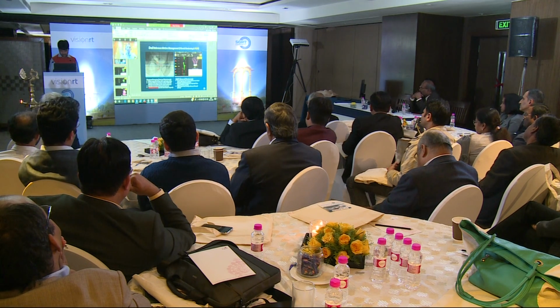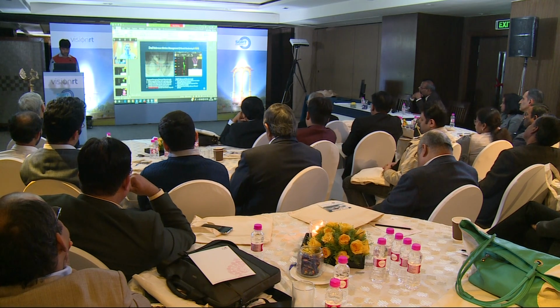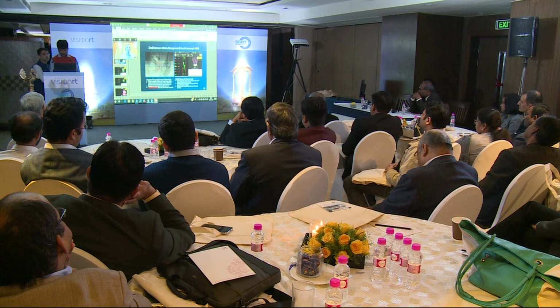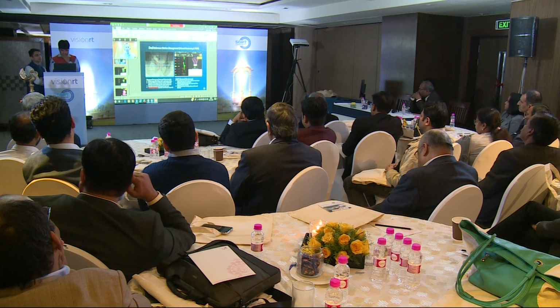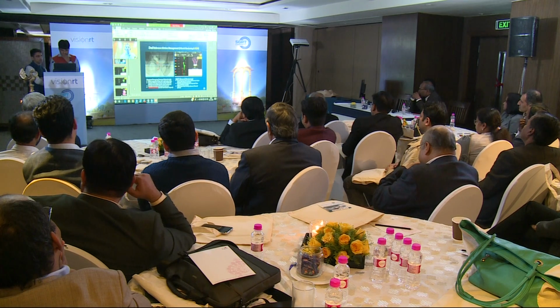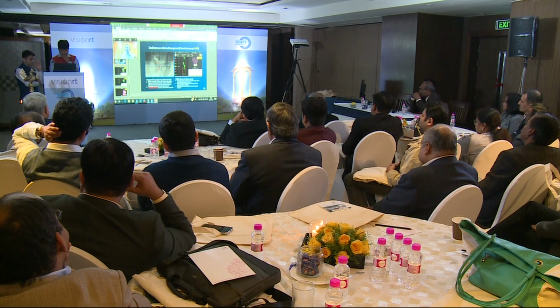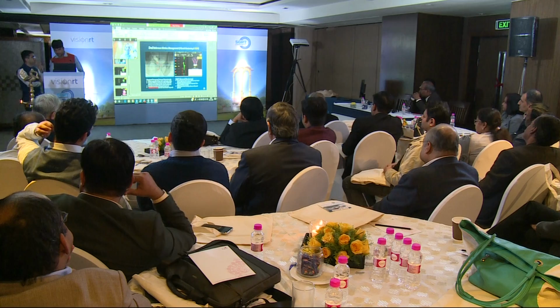So we don't have to have our attention focused on there. We instead have our attention focused on the internal anatomy, and in some cases we've seen a gas bubble pass through the rectum, and the prostate will shift posterior or shift to the left real quick, and you can immediately intervene in that SBRT prostate while not having to worry about, did I see him move? Did the AlignRT see him move? You're focusing more on what's clinically relevant during the delivery and letting AlignRT make sure that the patient's not moving or adjusting.